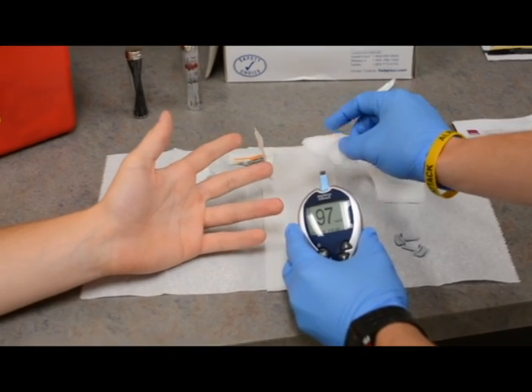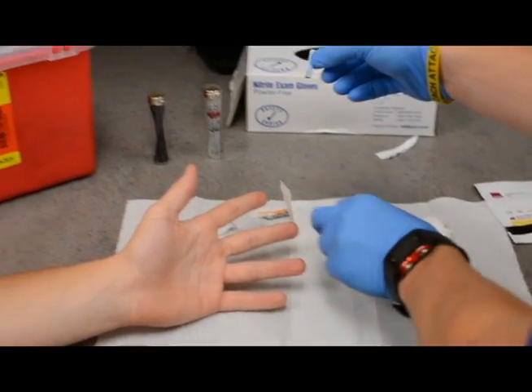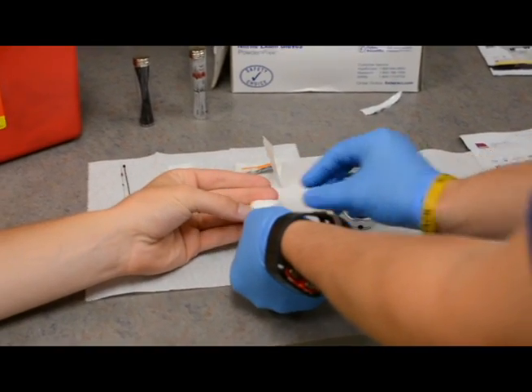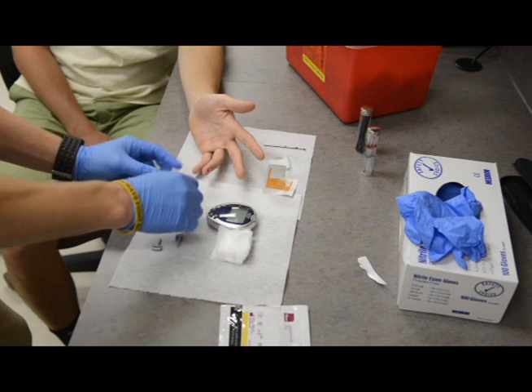Once it's filled up and it has enough blood, it'll start a countdown — 5, 4, 3, 2, 1 — and show you the blood glucose reading. After you're done with that, you're going to remove the strip and place it in the biohazard container because it's come in contact with blood, and then give your subject a piece of gauze.